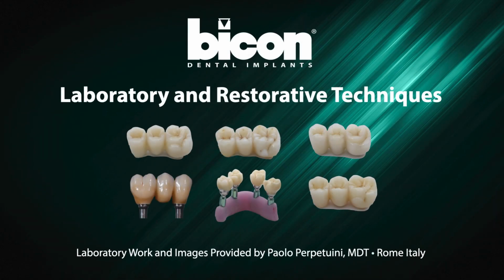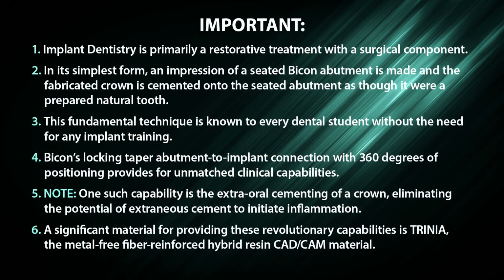Laboratory and restorative techniques. Important: implant dentistry is primarily a restorative treatment with a surgical component.